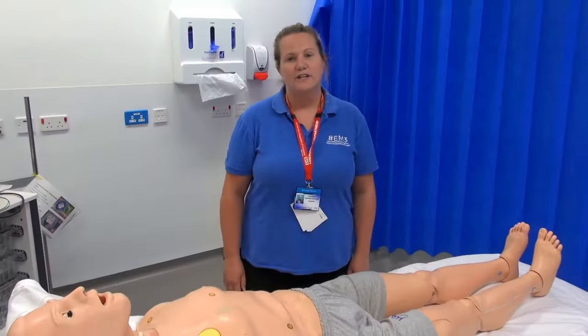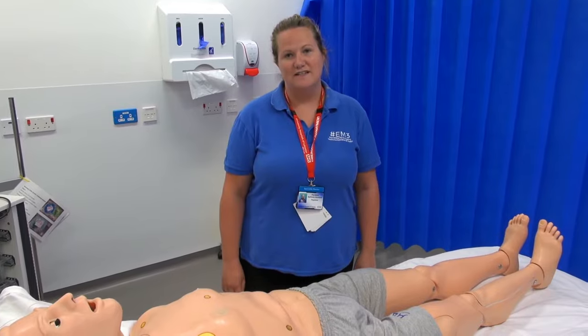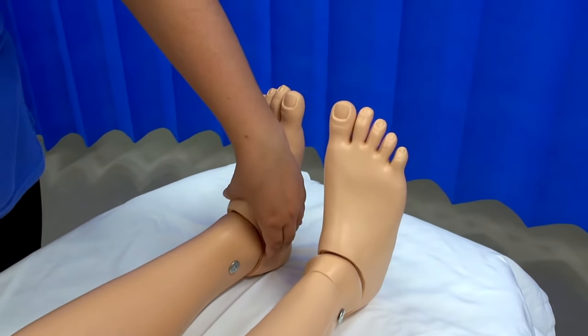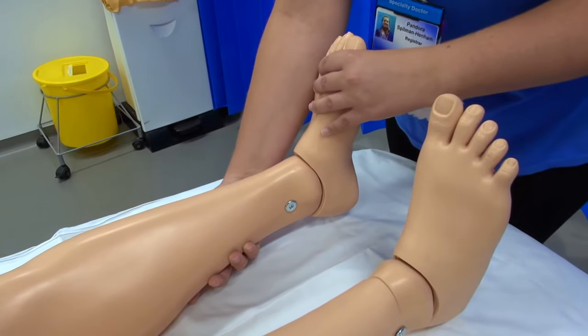Before applying the Kendrick Traction Device there are a few things to ensure. First, check the patient's neurovascular status in that limb. You need to make sure the patient is either sedated, has a nerve block in place, or is well analgesed, as this is going to be a painful procedure. You also need a second person to help stabilise the limb.